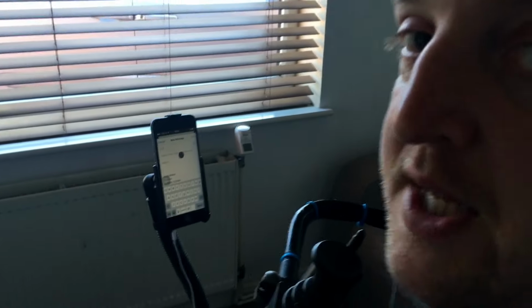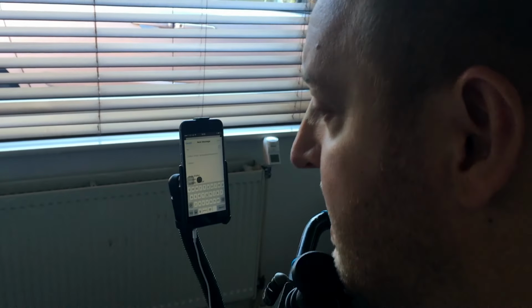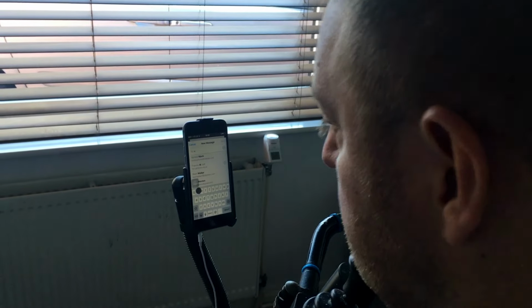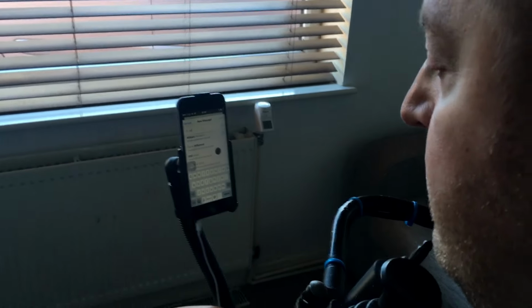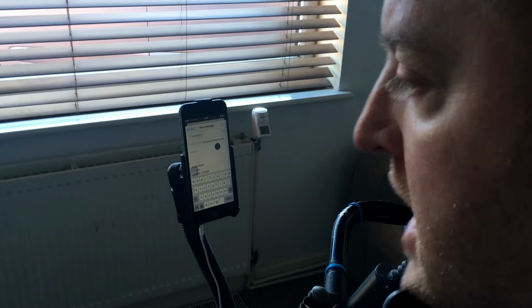And really interestingly, I've now got a keyboard. So with the keyboard, that enables me to type. So I'll send this one to Will, who's our cameraman for the day, just because this is a very inclusive session. So Will Wade of the A Centre, left to select, remember. I'll put a subject in.